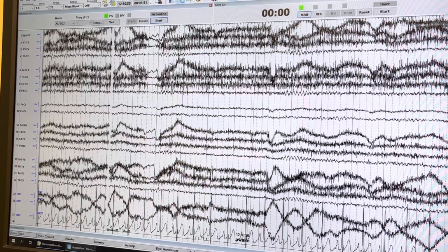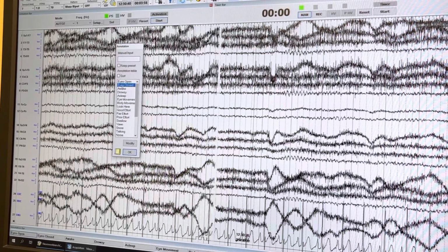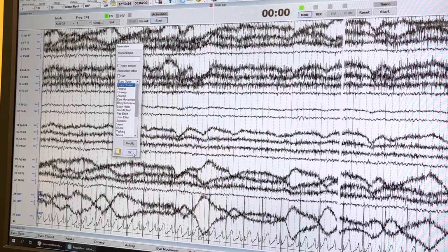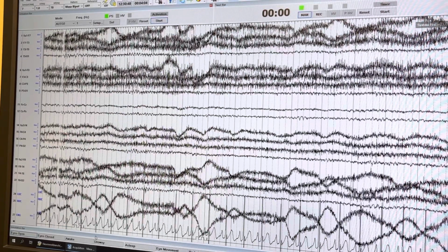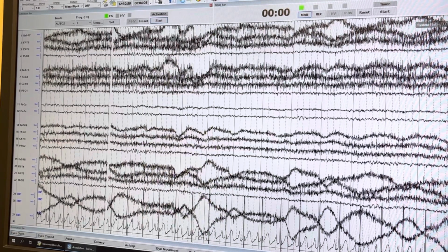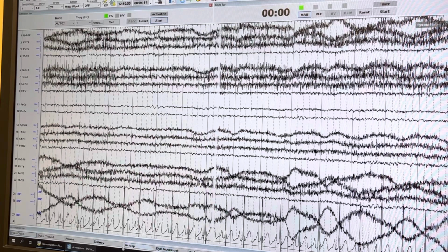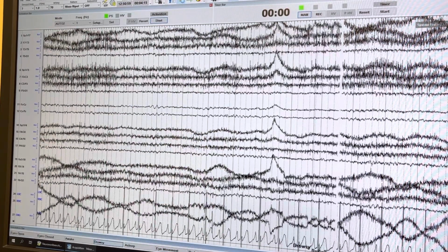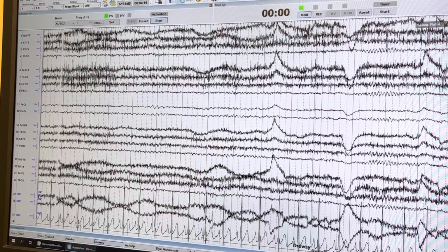So there's 3 ways to annotate. You can right click, annotate in here for manual input. You can use these inside this box, or you can use this line down here. If you look at this annotation viewer here, there's a bunch you can use down here. She's drowsy here, so I'm just going to put drowsy. And then if you want to go to the next line of annotates, you just hit next right here.